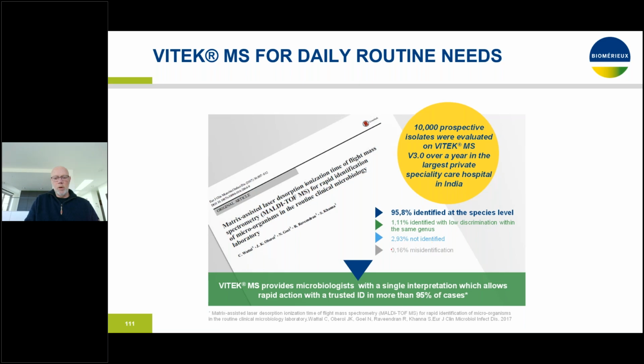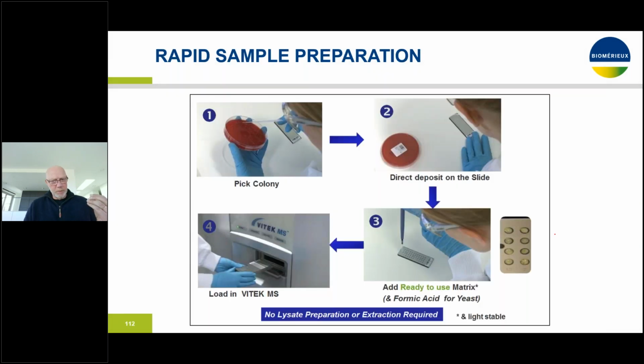And then of course, because this is biology, there are always misidentifications because of mismanagement of a sample, because somebody forgot to put the matrix on a specimen, or maybe too little material was put on a plaque. So there are things that can still go wrong. But well, look at the worldwide COVID-19 vaccination campaigns, and you'll realize that we're just humans, and anything we do goes wrong to a certain extent. So it is important to realize that this should be easy.